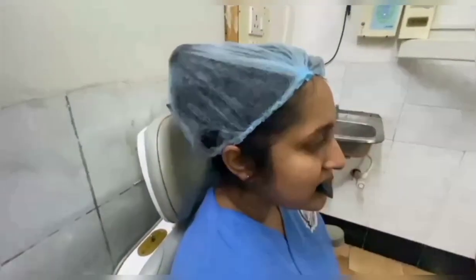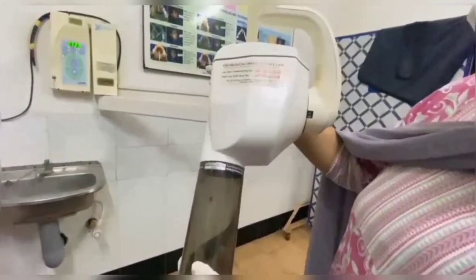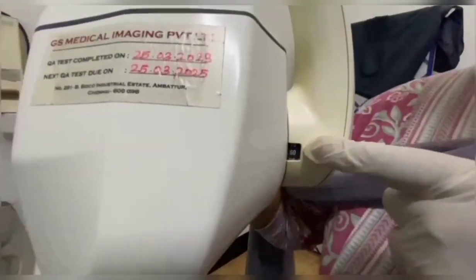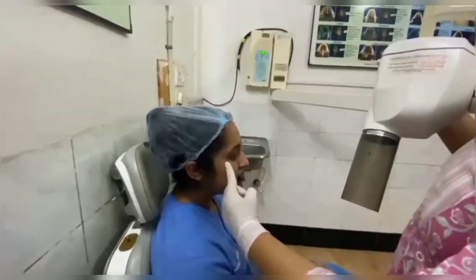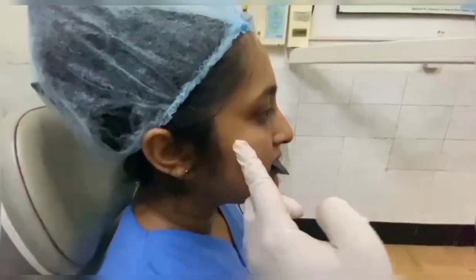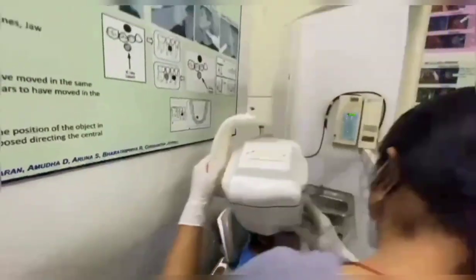The patient's head must be positioned such that the upper arch is parallel to the floor and the mid-sagittal plane is perpendicular to the floor. Then a vertical angulation of plus 60 degrees has to be given. The PID is positioned in such a way that the central ray is projected to a point 2 cm below the lateral canthus of the eye.